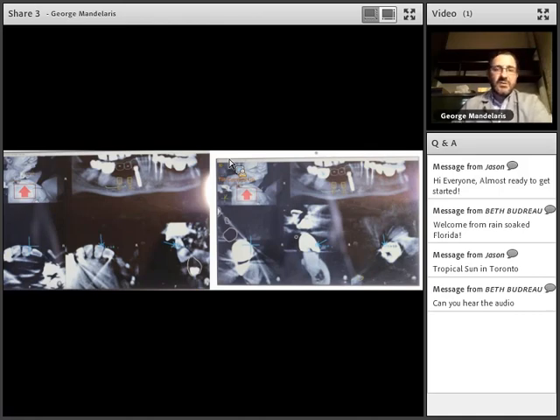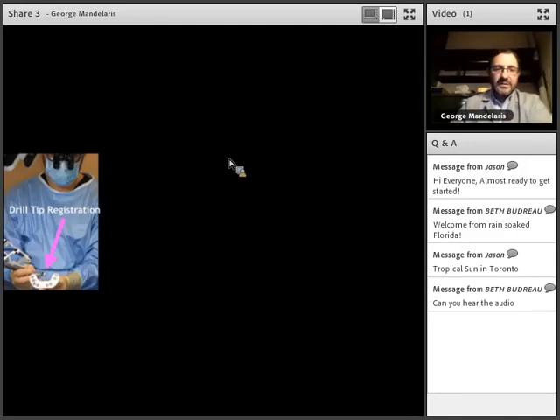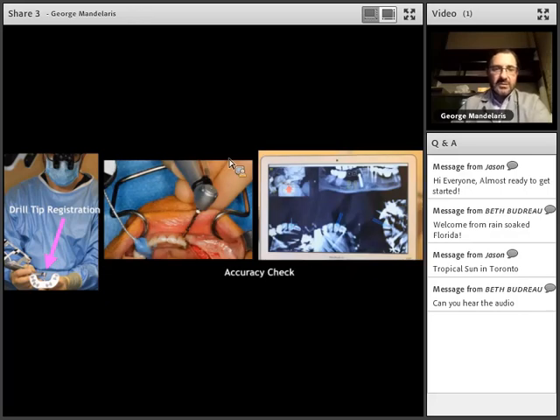Now this is a little different today because we're using a ball tip instead of a little metal tip as you are indicating here. With that, it's basically an arrow as we discussed earlier, but today with the ball tracer, you're going to look at something that doesn't have an arrow. You'll see actually a little ball that represents more of what you're using to do your contact mapping. Again, the calibrator is a little different. Today we're using that white jig that I showed you earlier to calibrate the axis and do our tip registrations. But here you can see the tip being registered on this lower right lateral incisor, and there's my plan. So an accuracy check now is being done with the drill, and you'll notice that I'm not in the pulp of the tooth.